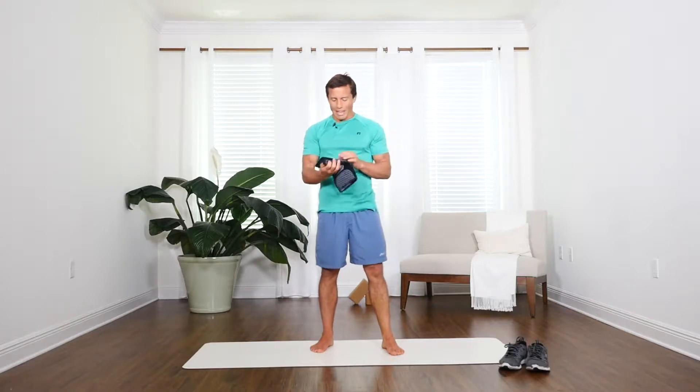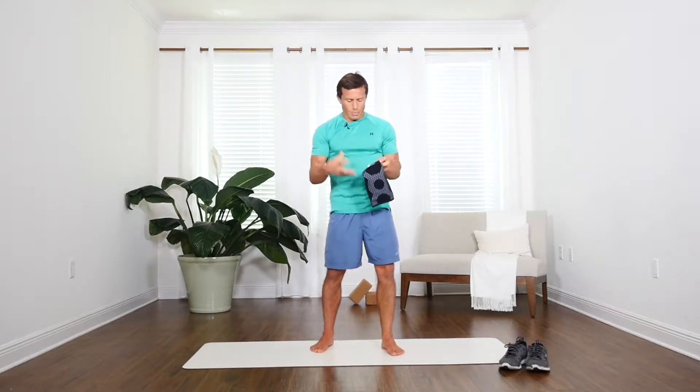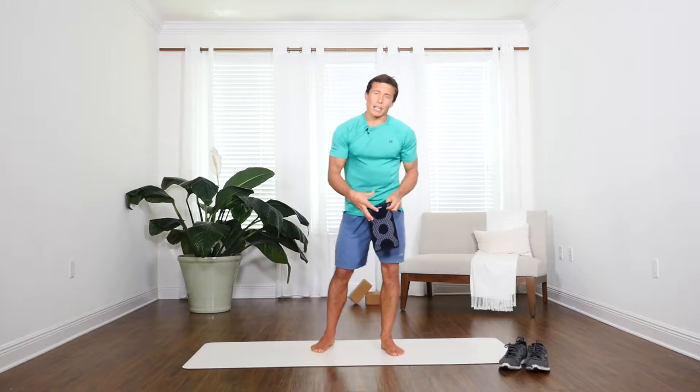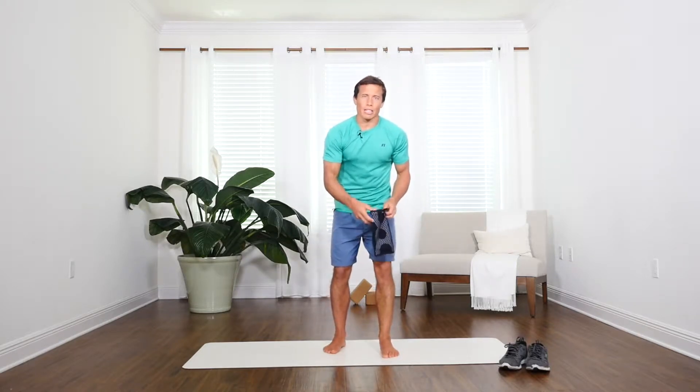Hi, my name is Brent. I'm here with the Azengears Compression Knee Sleeve. I like this sleeve for its ability to really protect my knee. It supports me and provides more circulation around the knee.